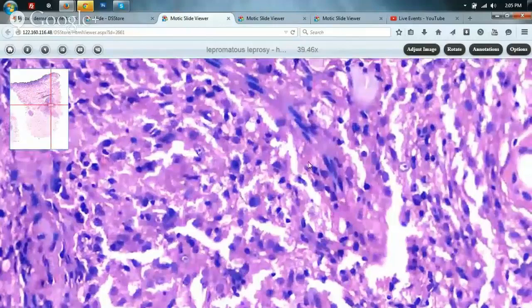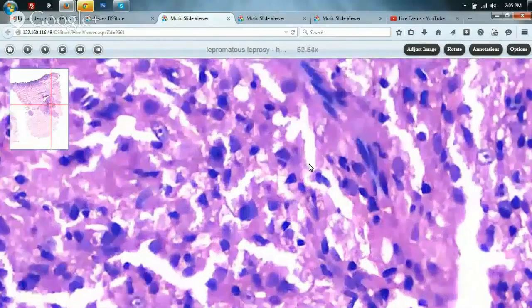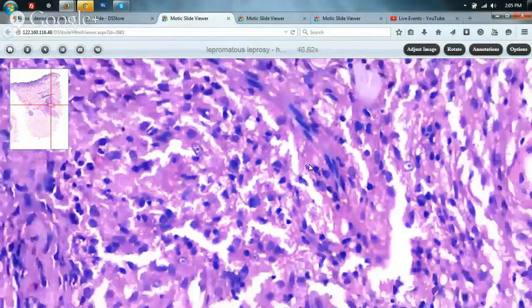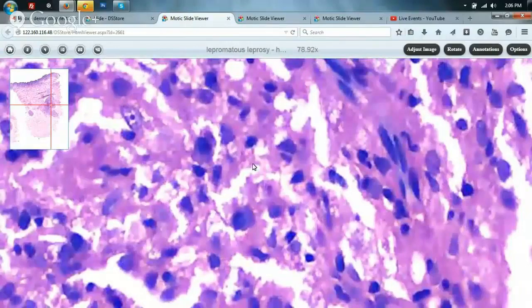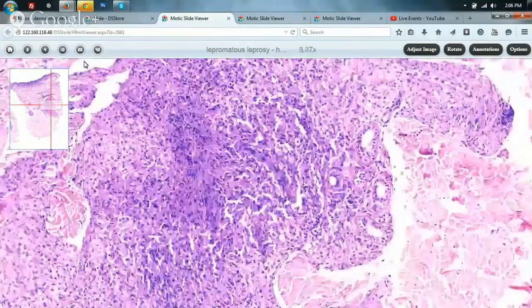In tuberculoid leprosy we saw epithelioid cells and giant cells, whereas in lepromatous leprosy the macrophages are simply engulfing the bacilli but are unable to destroy them, hence the foamy appearance. The bacilli cannot be seen in a simple H&E section and are better visualized in a Fite-Faraco stained section.